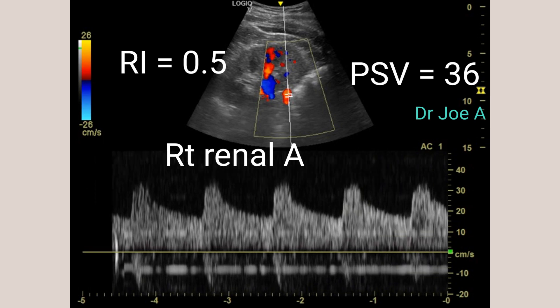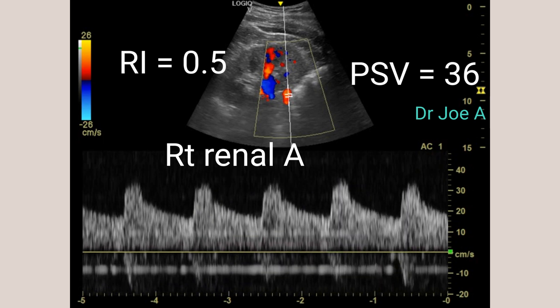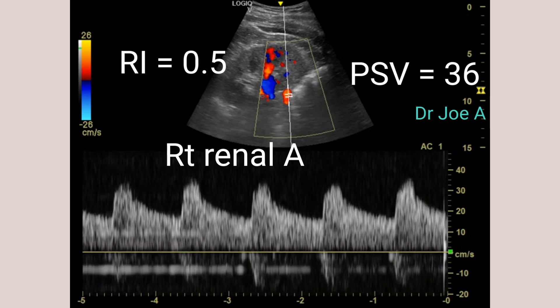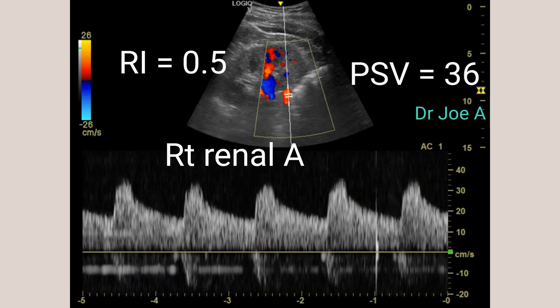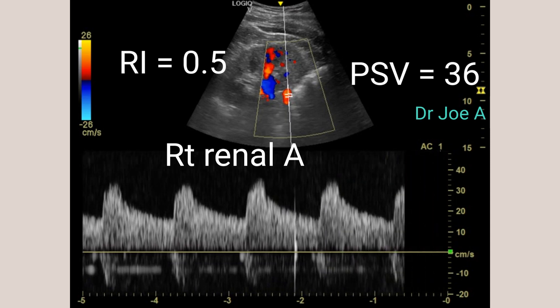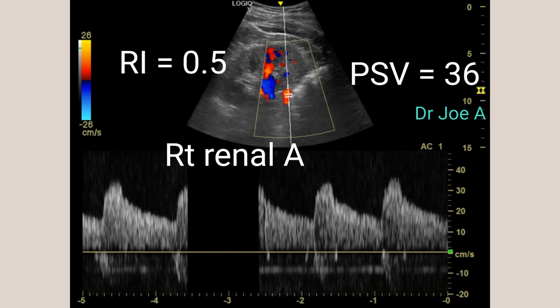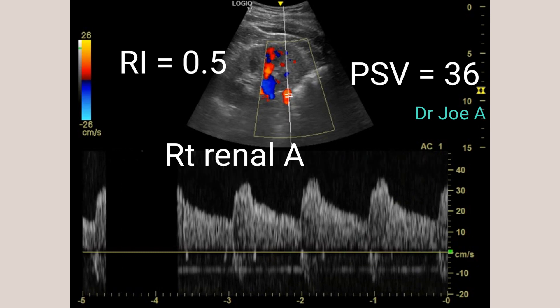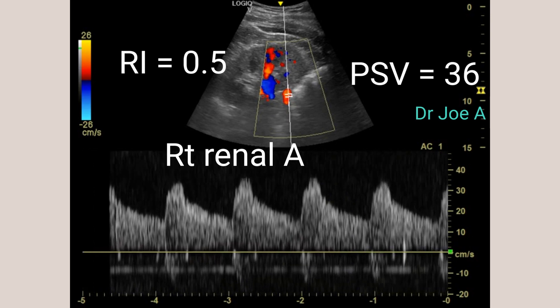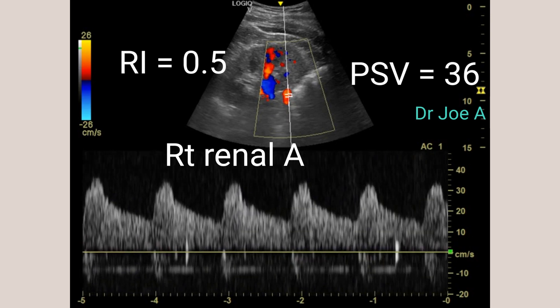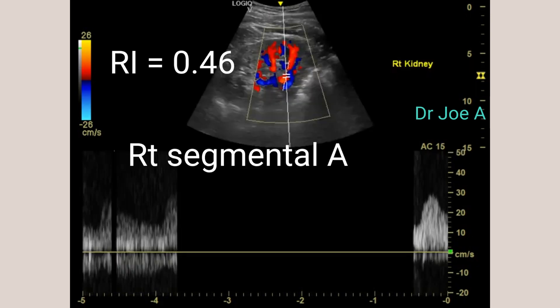Both renal arteries measured 0.7 cm in diameter, which is normal. The waveform of the renal arteries on spectral Doppler also appears normal.